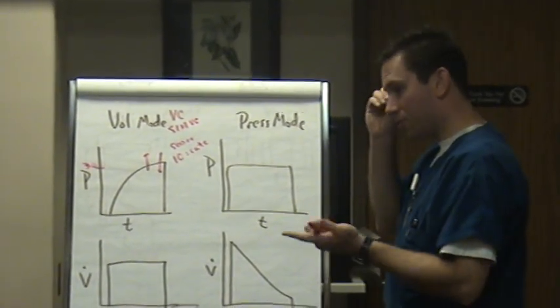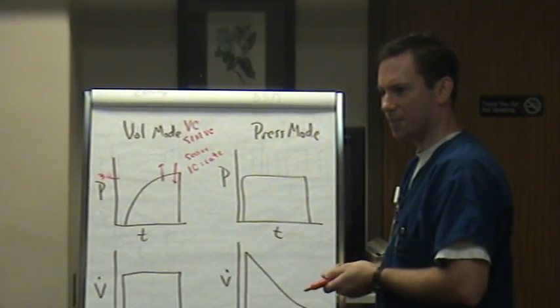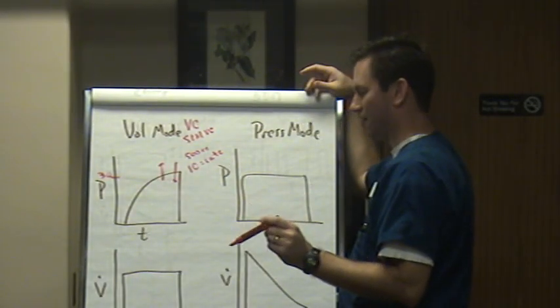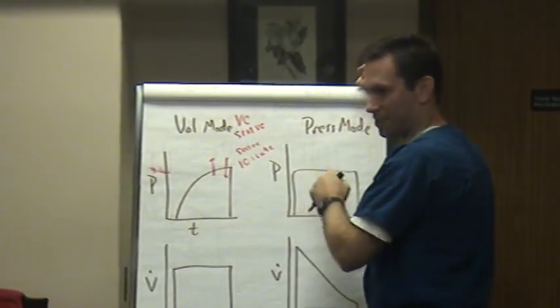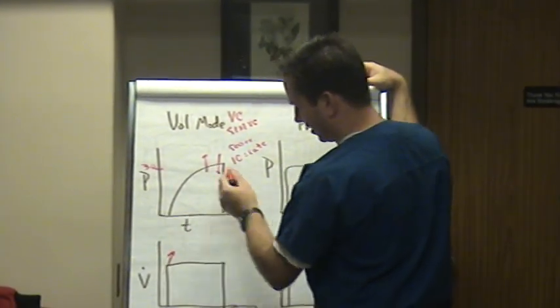Now, do you think you do fine on volume mode? If I intubated y'all, would y'all be fine on volume mode probably? Yeah. Y'all have healthy lungs, and we'll talk about that. You'll see that this flow waveform is the reason why you would do fine, but if you were sick, you won't do fine. So pressure can go up and down based on the tidal volume I have set, okay? And so here's how flow is released from the ventilator on the same breath.